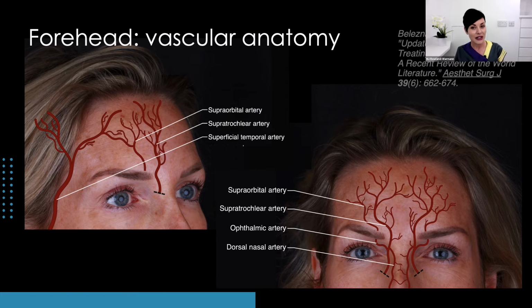According to a study by Agorgianitis in 2020, the average depth of the main forehead arteries is 1.5 millimeters with a diameter of 1 millimeter. It's expected that the supratrochlear artery courses 1 to 2 centimeters lateral to the midline and the supraorbital 2 to 4 centimeters. However, their course is highly variable and may have a plethora of branching patterns. So the only way you can predictably reduce risk when treating these areas with filler is to use ultrasound to identify the vessels.